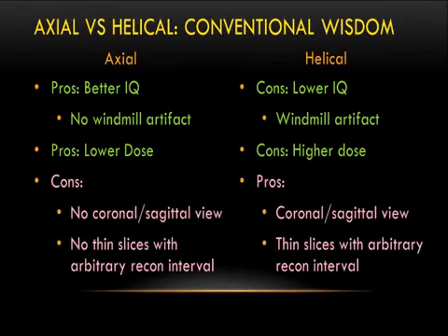There's this other aspect of whether to do helical scan or axial scan. And there have been papers about it, and there are lots of debates about it. Okay, I have sort of a mixed feeling. I have a preference and I have a bias, but I cannot strongly advocate one or the other. Okay, it's a personal decision to some extent.